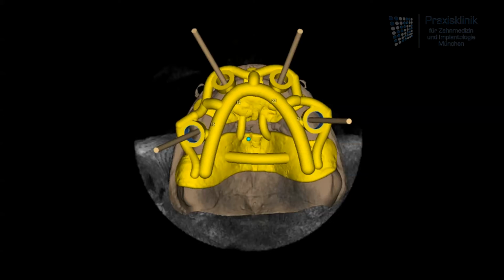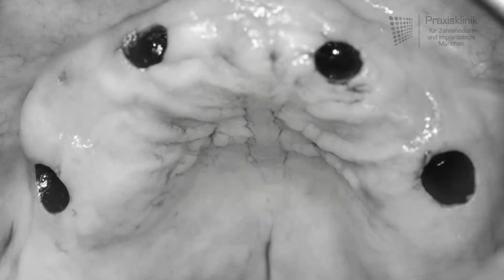This kind of template enables us to transfer our virtually planned implant position into reality. So this template will guide our implant drill right to the defined position of the implants. In favorable terms, which means in this situation that we have enough bone at the planned implant site, we can place implants without cutting the soft tissue, having only a small punch in the area where we want to place our implant.